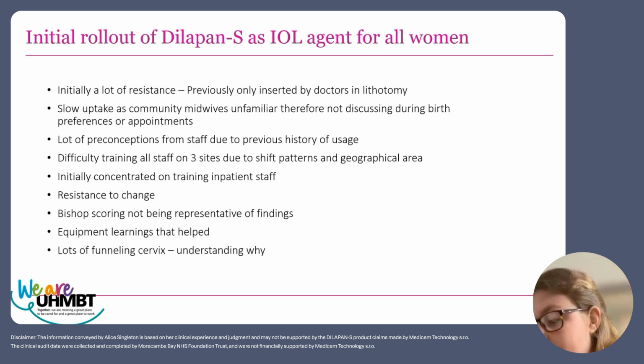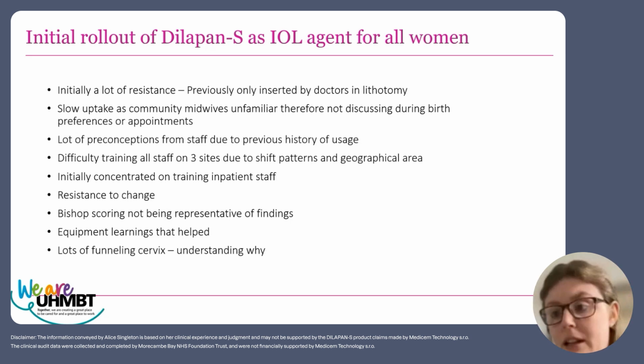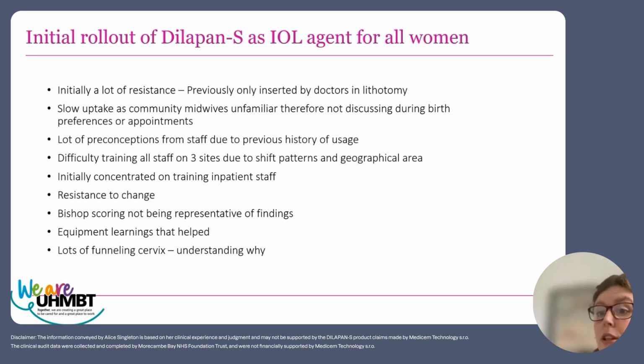Equipment learnings that helped. Those of you that are using Dilapan at the moment might be really familiar with these kinds of things. For example, the wedges were really helpful. We didn't have those initially, but with the wedges, the women sit on the top end of the wedge, and it causes their coccyx to swing out of the way, just to give you a bit better visualisation when you use a speculum.